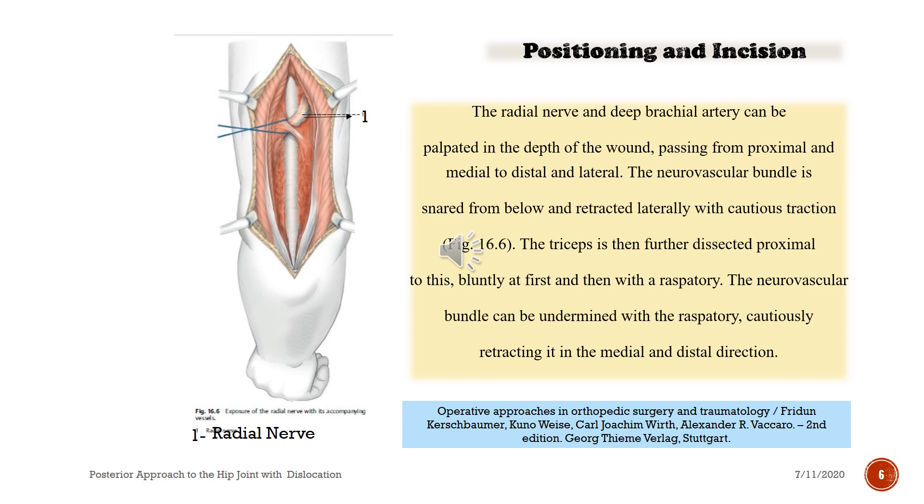The radial nerve and deep brachial artery can be palpated in the depth of the wound, passing from proximal and medial to distal and lateral. The neurovascular bundle is snared from below and retracted laterally with cautious traction. The triceps is then further dissected proximal to this, bluntly at first and then with a raspatory. The neurovascular bundle can be undermined with the raspatory, cautiously retracting it in the medial and distal direction.